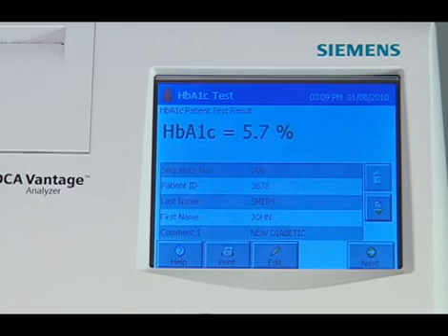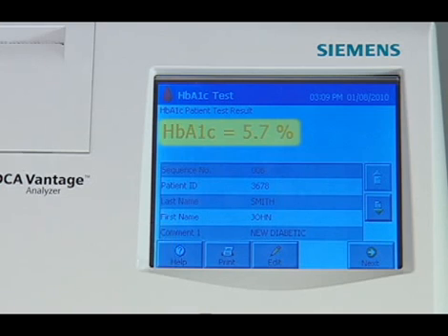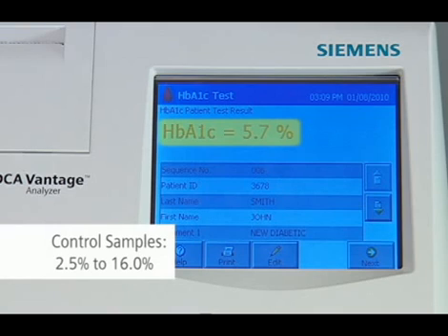The A1C test result displays the hemoglobin A1C percent. The reporting range for patient samples is 2.5 percent to 14.0 percent A1C, and for control samples is 2.5 percent to 16.0 percent A1C. The test is linear throughout the range.